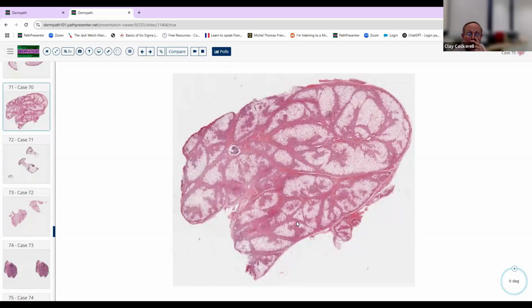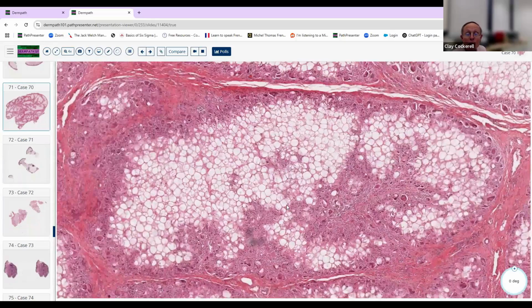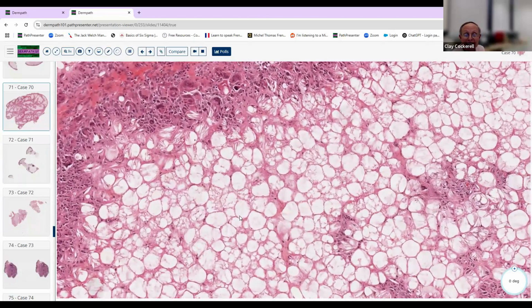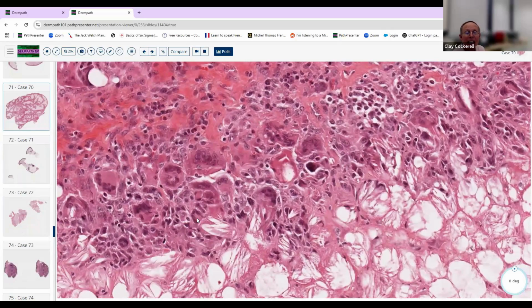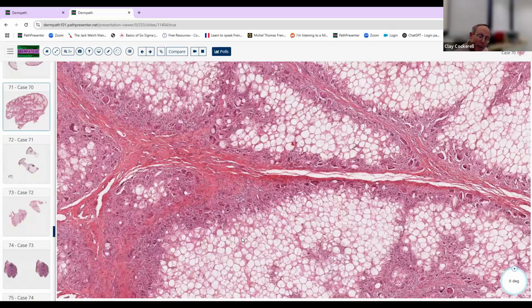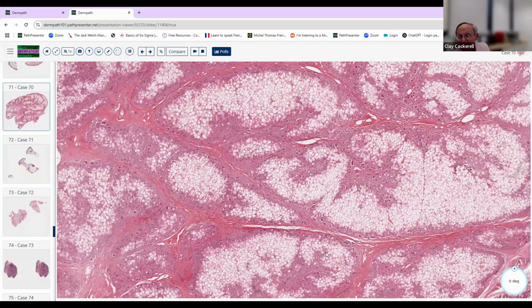Okay, this looks different because it's cut funny, but the clue to this diagnosis is recognizing the changes in the fat. These are granulomatous areas here with crystals in the fat and in the histiocytes. And sometimes they'll show you kind of a weird lesion. I remember they showed us on our board exam a really bizarre high-power view of KS clinically that looked really weird. It almost looked like just a sea of purple. It didn't really look like a tumor. So sometimes they'll do that. So this is basically just an incisional biopsy of the fat here.